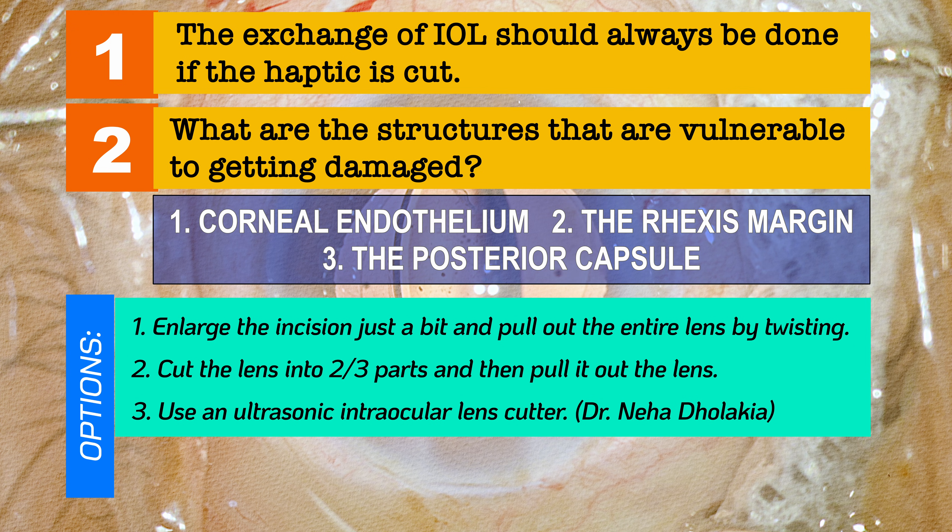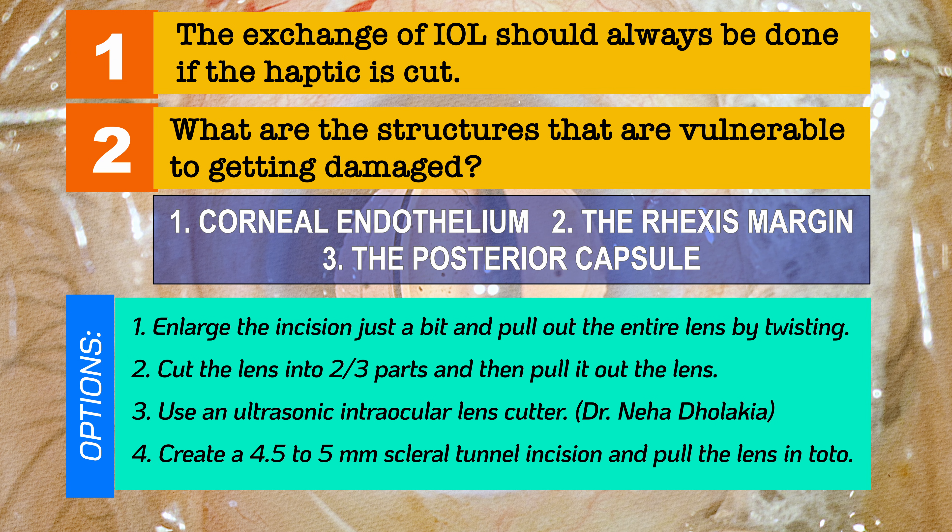The third, more novel way is to use the ultrasonic cutter devised by Dr. Neha Dolakia. The fourth option: if you are not experienced with either of those, please don't hesitate to create a small scleral tunnel incision of about four and a half to five millimeters and pull the lens out in total — that is perfectly fine, just like how we do in SICS. There's no need to panic at all.